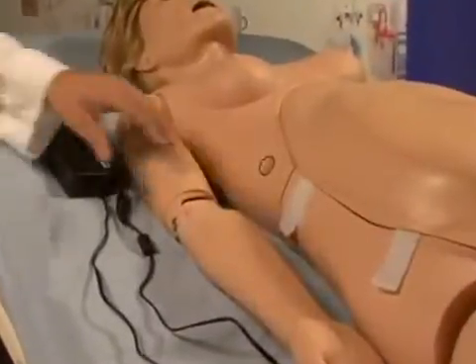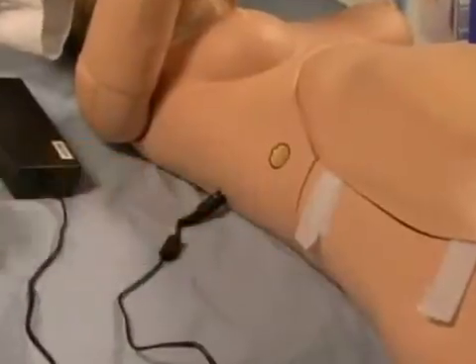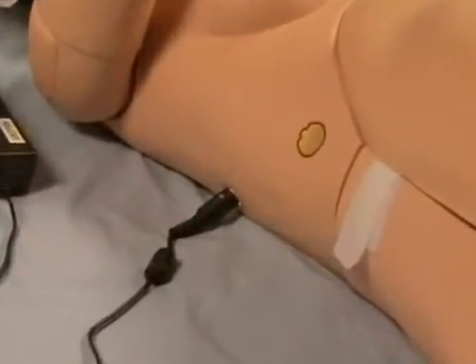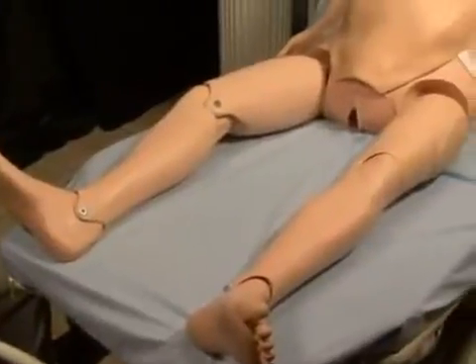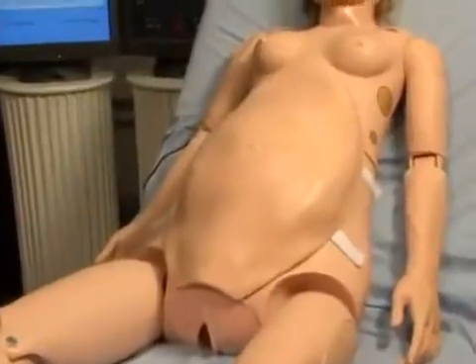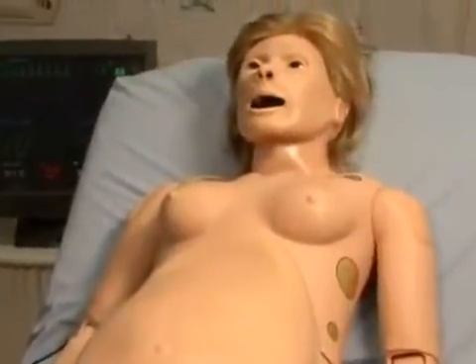Once NOEL has been assembled, connect the power supply to her right side. NOEL will not turn on without being connected to the power supply, although it will become tetherless when she is to be transported from one location to another and the user wishes to continue the labor process, such as rushing the patient from the delivery room to the OR.